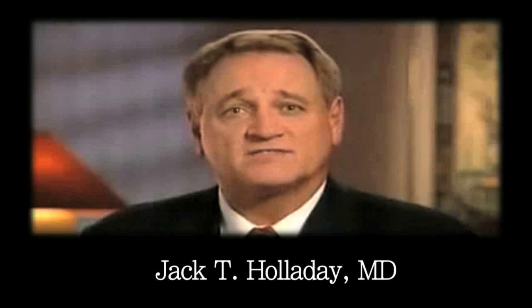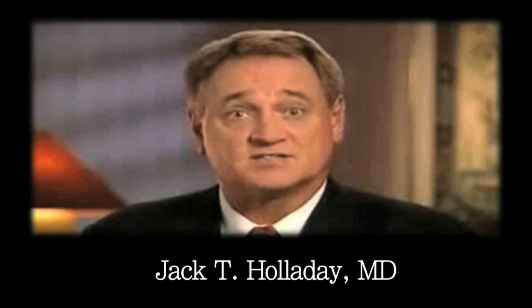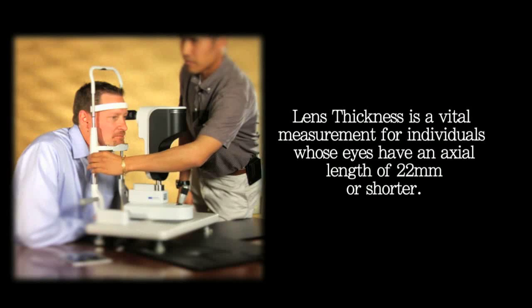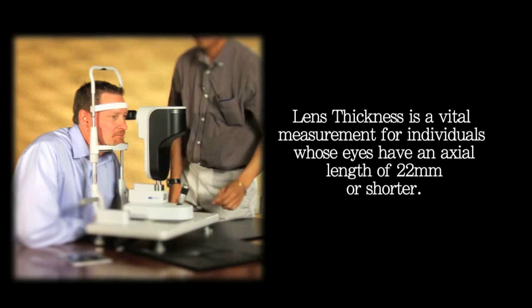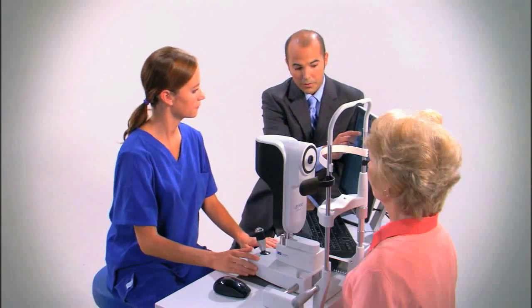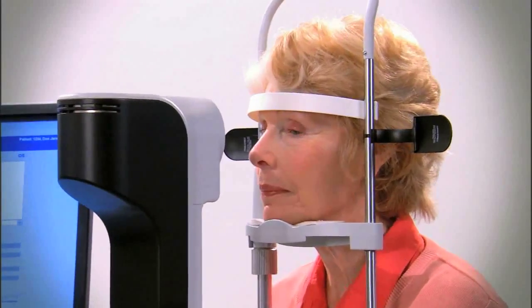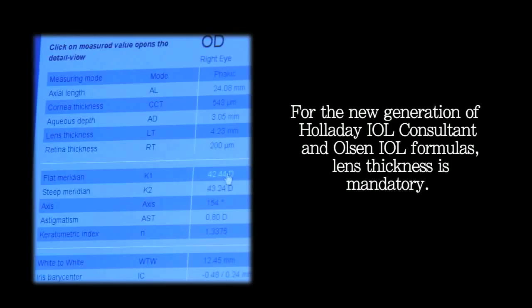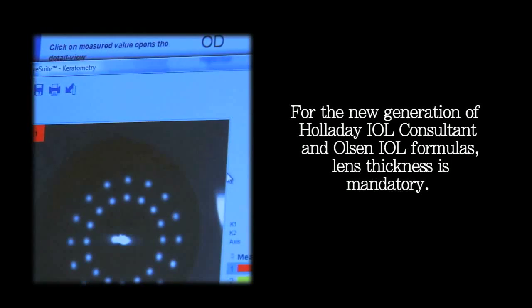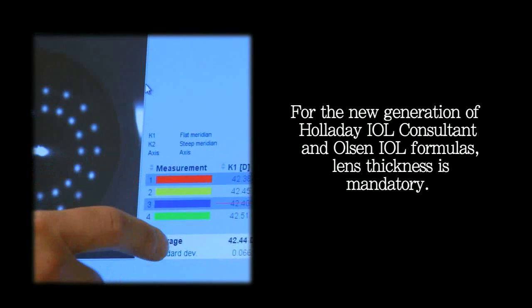According to Dr. Jack Holliday, author of the Holliday IOL Consultant, lens thickness is a vital measurement for individuals whose eyes have an axial length of 22 millimeters or shorter. It is crucial to understand the necessity for lens thickness, especially for patients with short eyes. For the new generation of Holliday IOL Consultant and Olsen IOL formulas, lens thickness is mandatory.